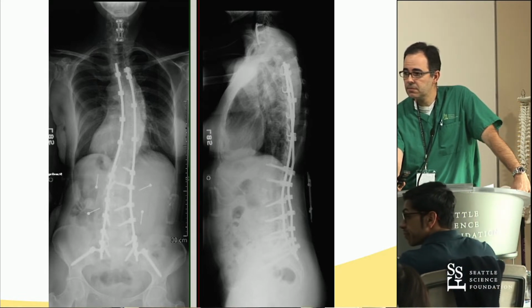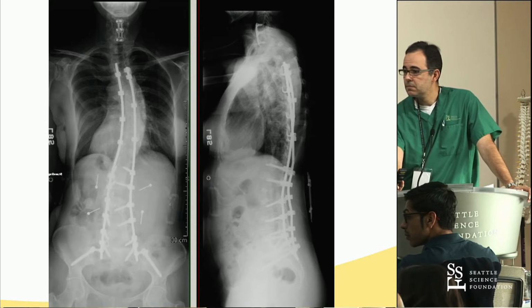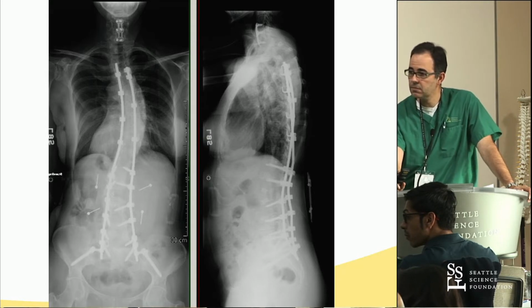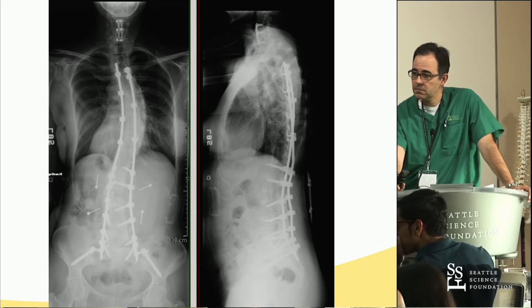If I can weigh in, I agree completely with that, and I have had the painful experience of stopping with just S1 screws under a big deformity. I think the two arguments, number one, is avoiding a U-type or H-type lumbosacral dissociation fracture, which I've seen in one of my own patients and in at least 2 or 3 that were done elsewhere.